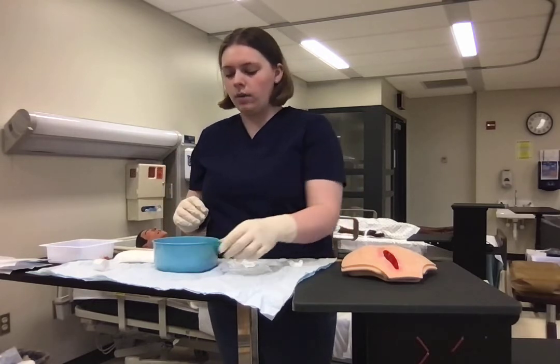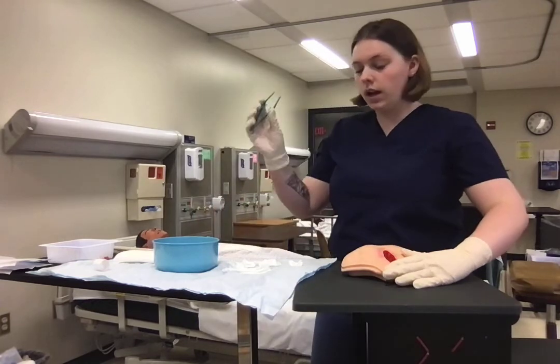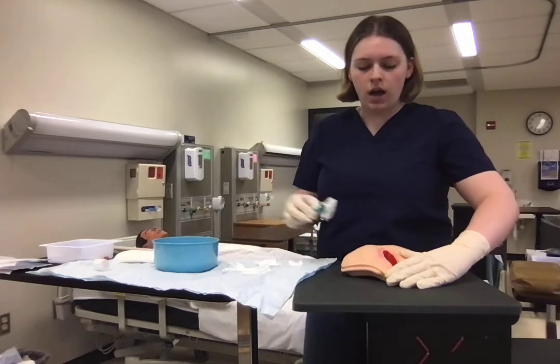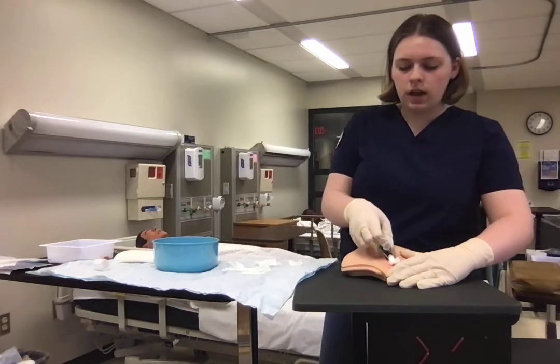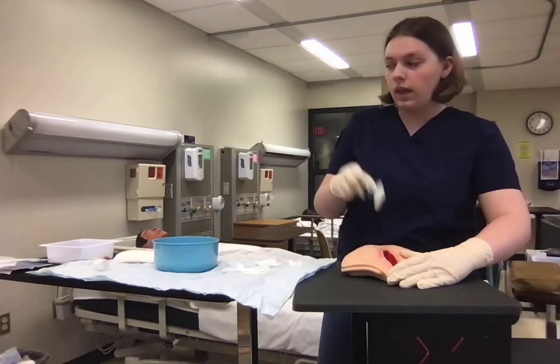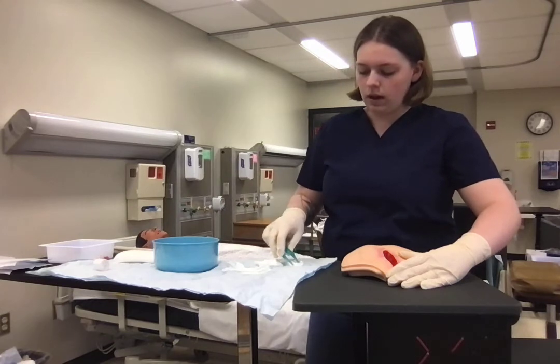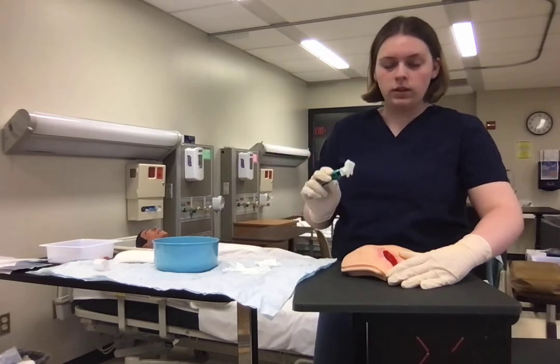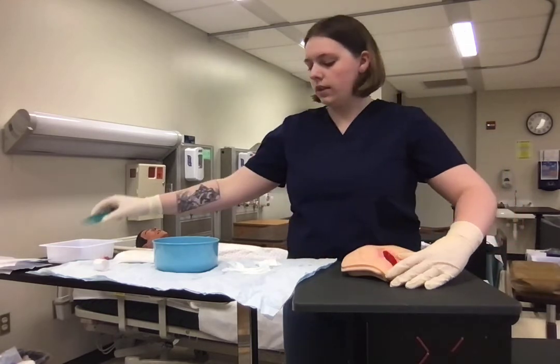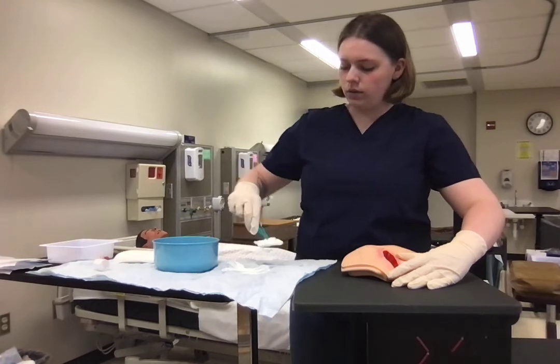Alright, and now I'm going to establish a clean hand and a dirty hand. So I've got my dirty hand here and my clean hand is my right hand. I'll go ahead and take my moist gauze and clean down one side of the wound. Then that would go into the trash. And then I would go ahead and take another moistened gauze and wipe down the other side. Throw that in the trash as well. And then the final piece of gauze I would use to wipe down the middle.